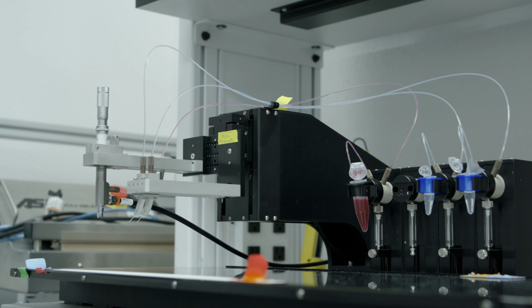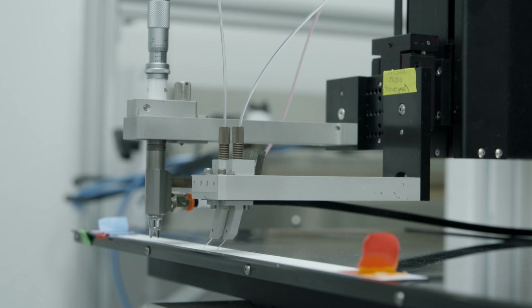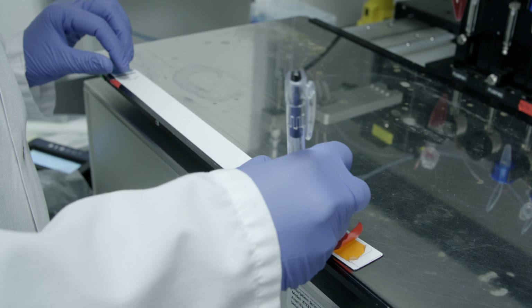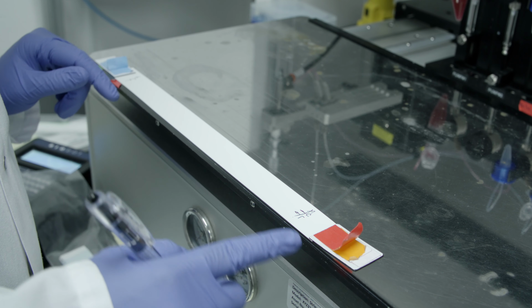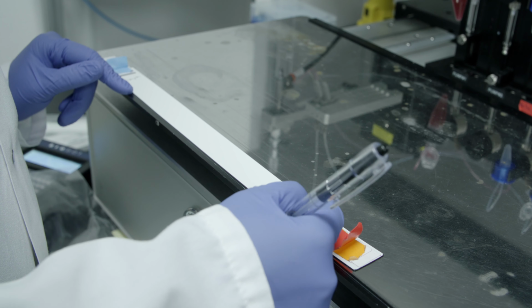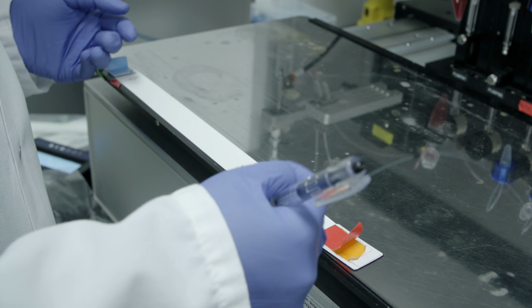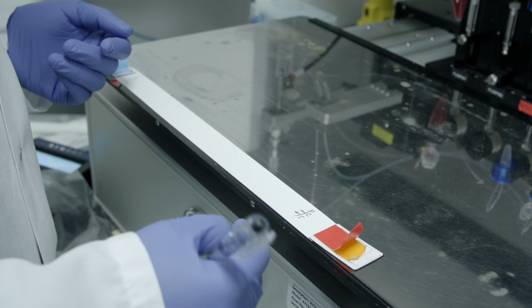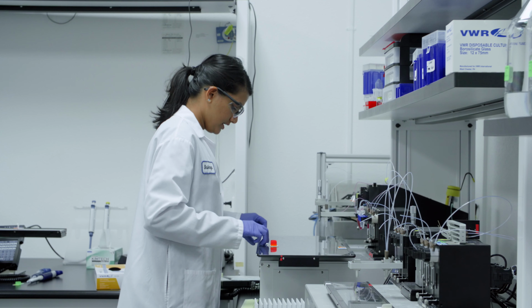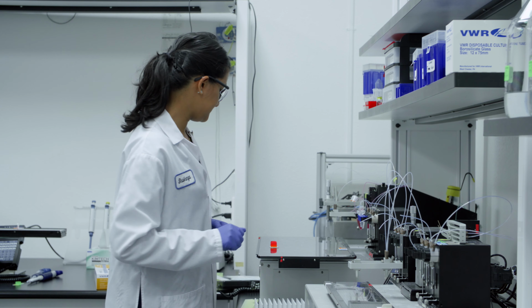So there's 2 parts of lateral flow. We're dispensing the capture antibody, and then later we will dispense the detector antibody. So I've just finished up marking where the lines were dispensed. I've labeled the control line where we dispensed our control antibody to ensure that the test was run correctly. And then here, our test line, that's the line that we care the most about. That is where our capture antibody is. And then you would let that dry in the oven for 30 minutes.